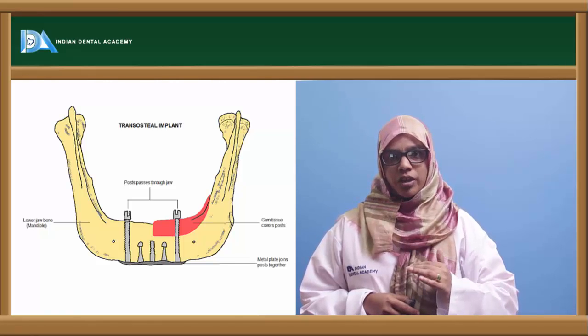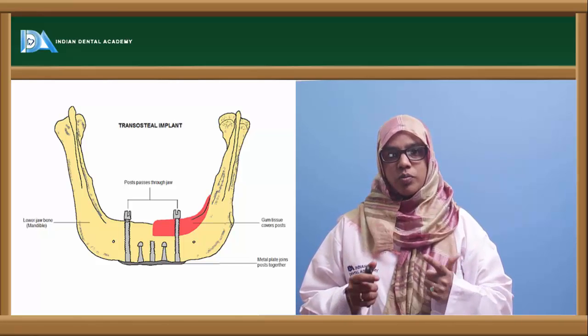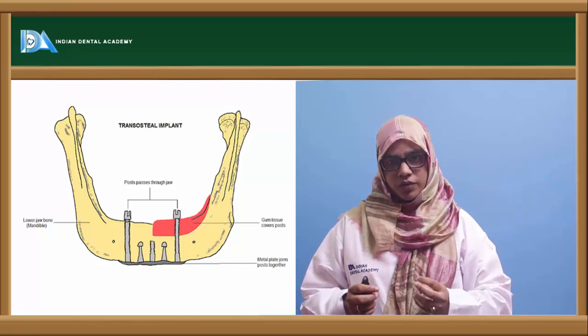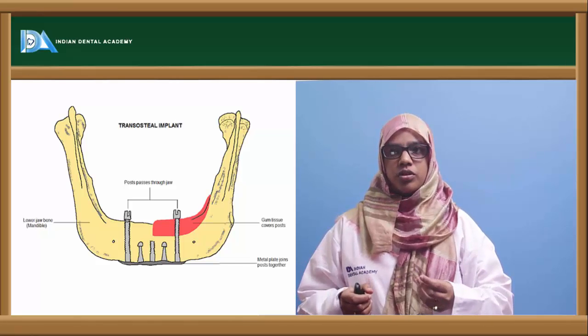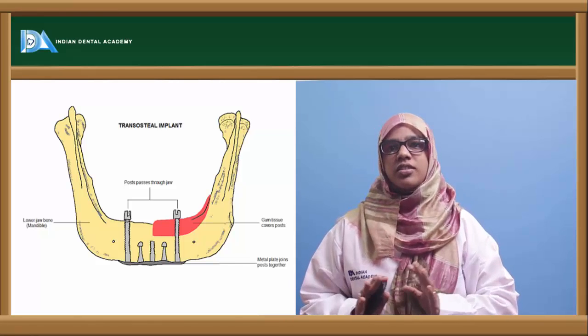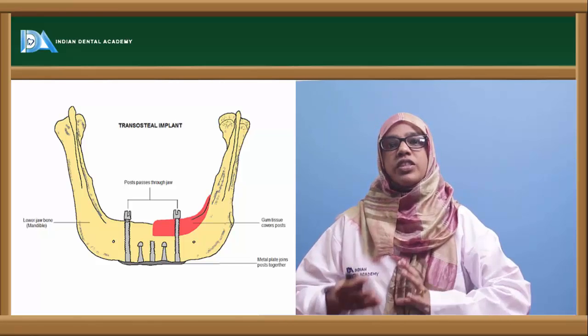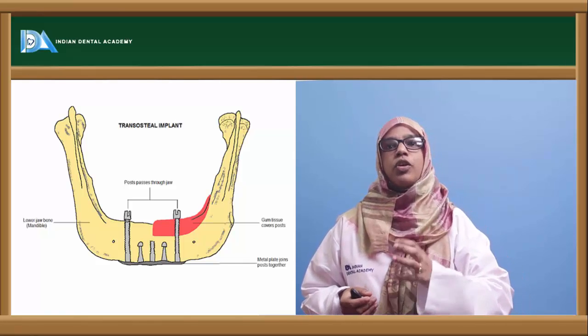Now this slide shows you a transosseous implant wherein you pierce the implant through and through, from the inferior cortex to the superior cortex, and you have a projection that is coming out. So basically the threads are there on the inferior and the superior cortex, and the center part is smooth. In these cases, osseointegration doesn't take place. There is actually osseofixation. It's like you fixing a fracture. You're taking the support of the cortical bone.